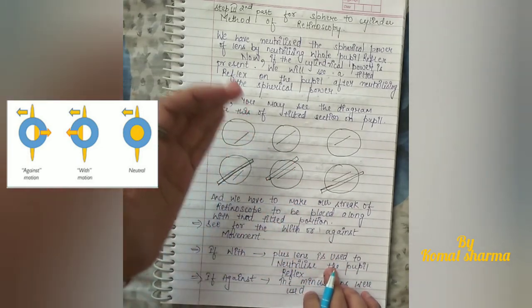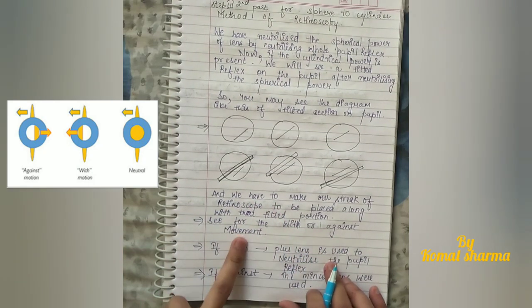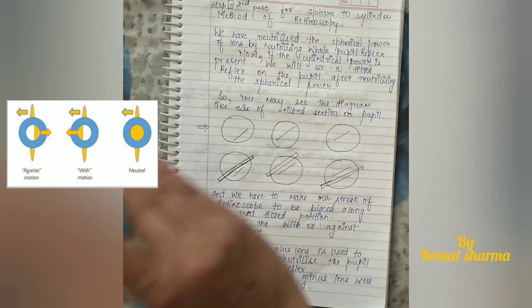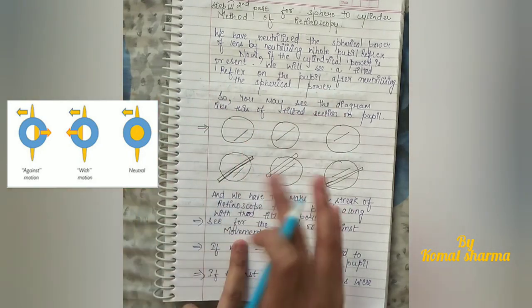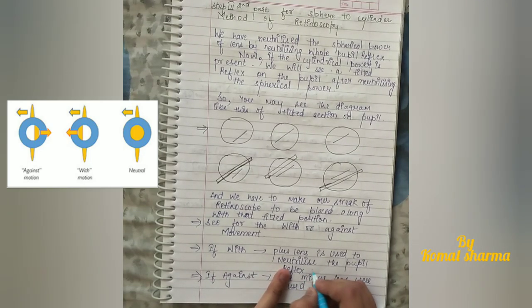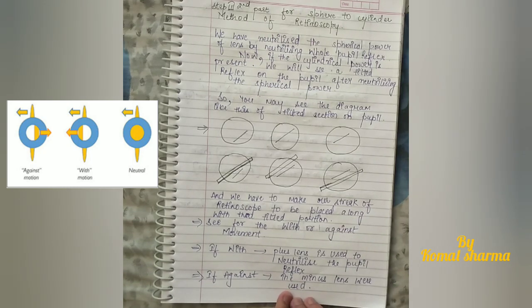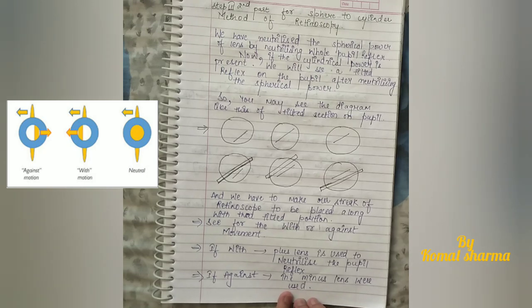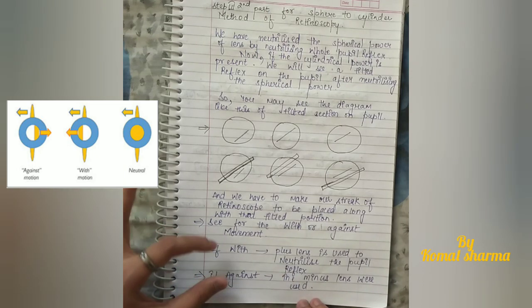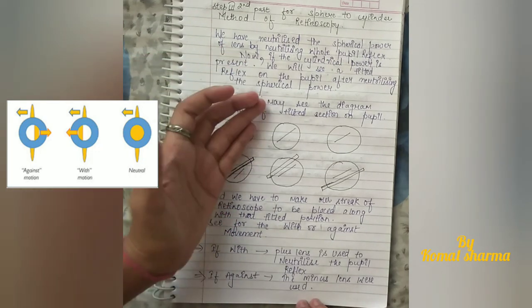To neutralize the cylindrical power, we check whether the tilted reflex shows a 'with' or 'against' movement along with our streak. If it is 'with,' we use a plus cylindrical power lens to neutralize the pupil reflex; if it is 'against,' we use a minus cylindrical power lens. The minus cylindrical lens is also taken from the trial set — we use the cylindrical lens to neutralize the with or against movement of the tilted reflex.